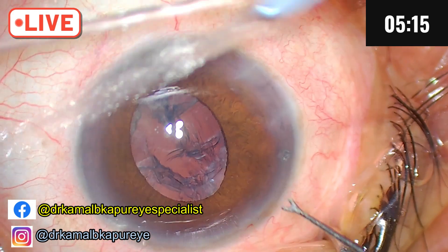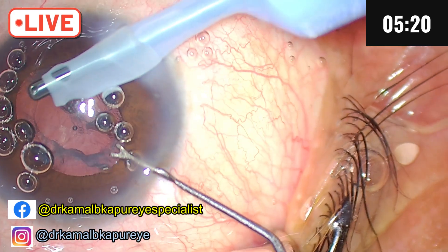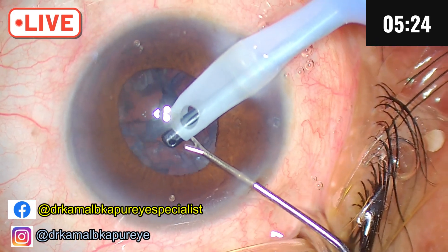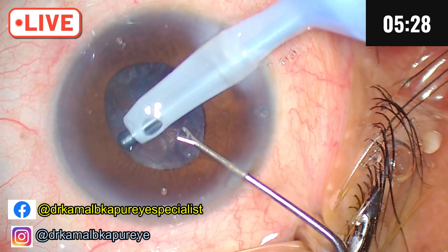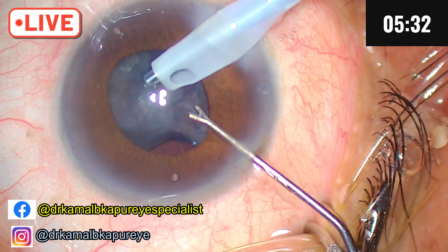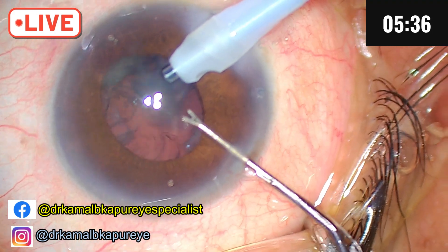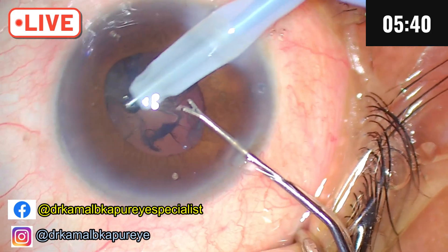The patient has been given 300 ml of mannitol prior to coming to the operation theater. The reason I did not want to make a larger rhexis was for fear of it running out, because whenever the intraocular pressure is high, all the vectors of the rhexis are oriented toward extending out. So the endeavor is to keep the capsule flat as much as possible.